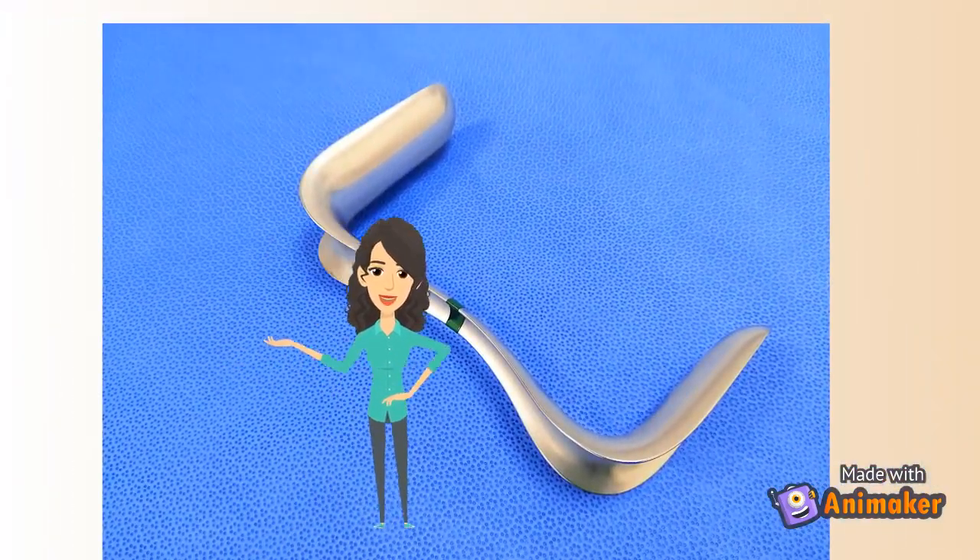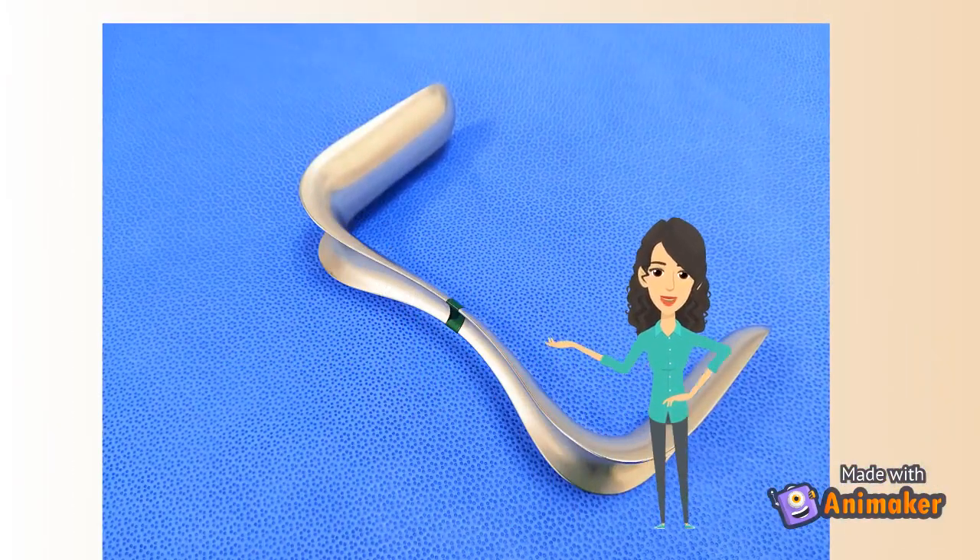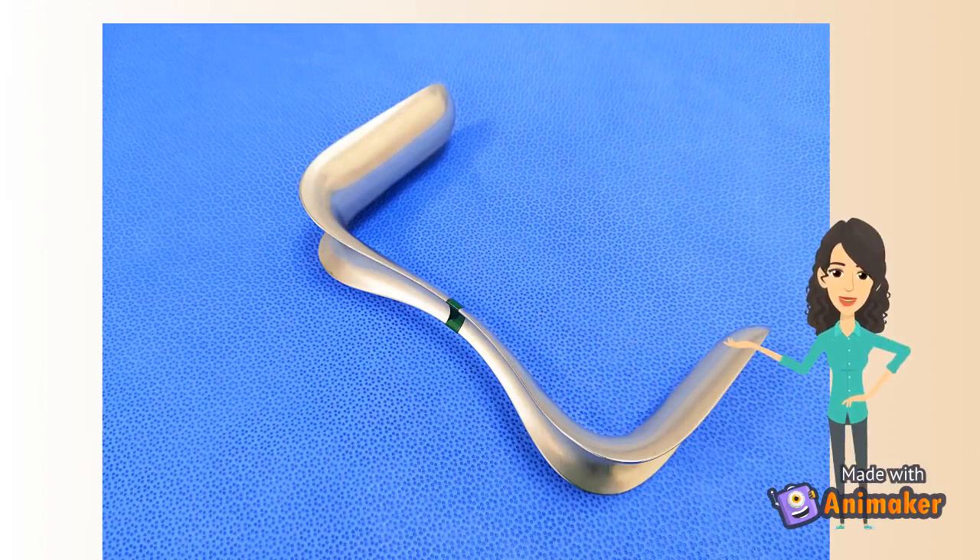Sim's speculum is the most commonly used speculum in gynecology and obstetrics. It is made up of stainless steel and is either single-bladed or double-bladed, as shown in the picture. In case of double-bladed, the two blades are of different sizes. The blades are rounded at the ends and a trough runs along the entire length of the instrument.